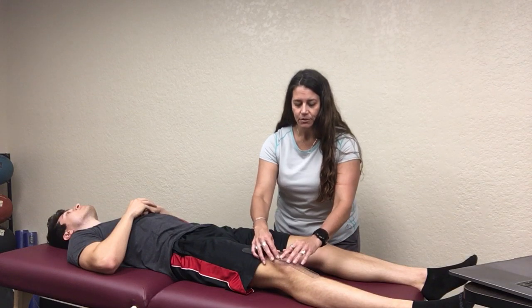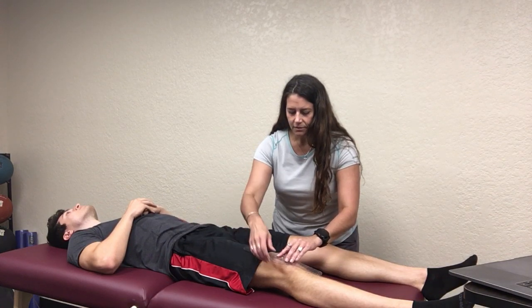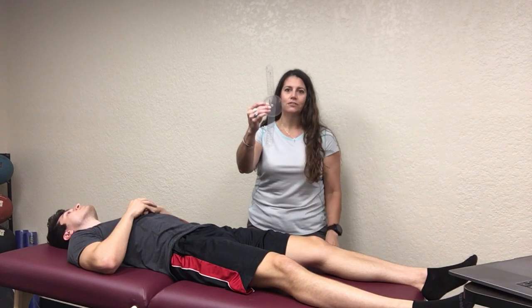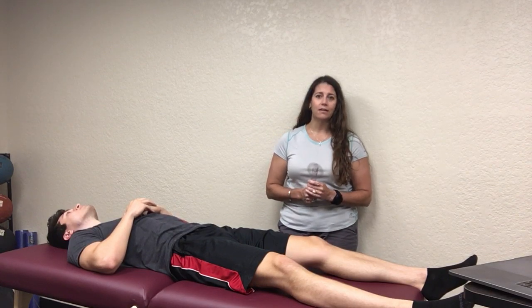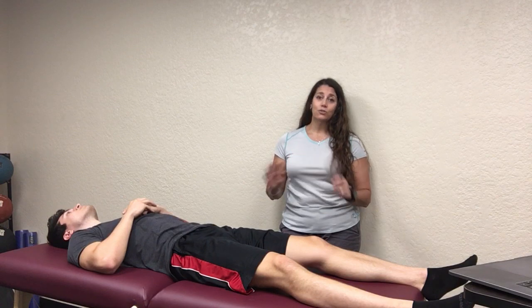And with him, as we line these up, we're going right through the tibial tuberosity, and straight up to the ASIS, and then you're going to look at the measurement. On his, not that you can see it, it's far away, but he has a 10-degree angle. And the angles that you're looking for are really 10 to 15 degrees. I've seen people with angles as low as 5, but you really need them to be in that area. If it's 0, that's totally abnormal.